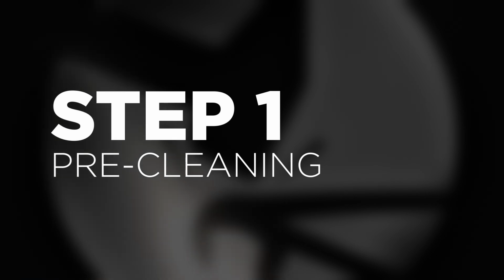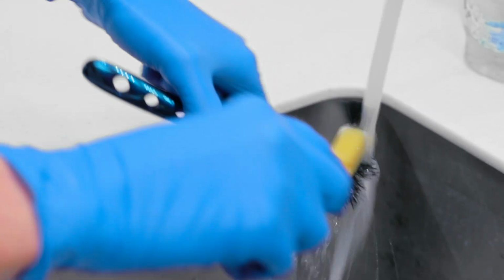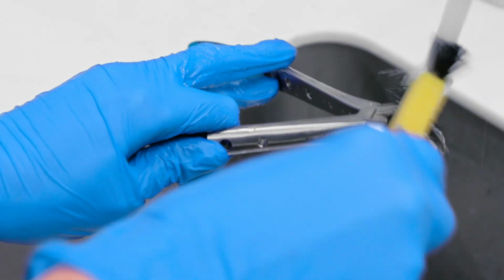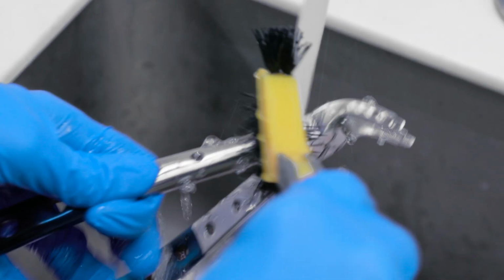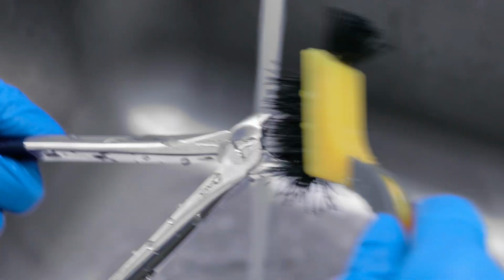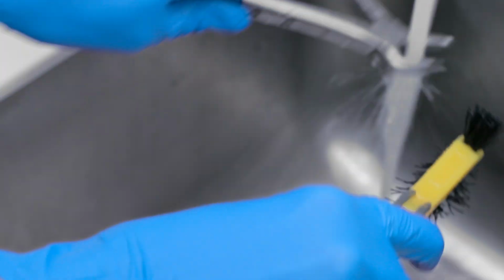Step 1. Pre-cleaning. All instruments must be thoroughly cleaned with enzymatic detergent or tap water to remove visible blood, protein, and other debris from surface, joints, serrations, and any other crevices prior to cleaning.